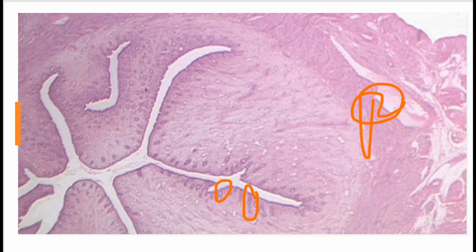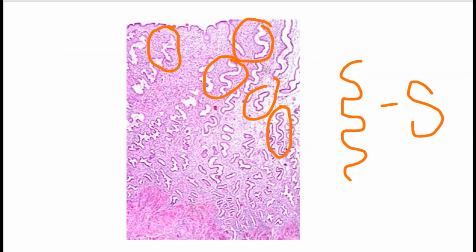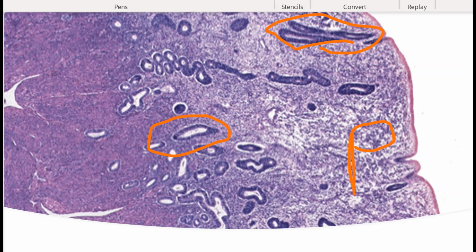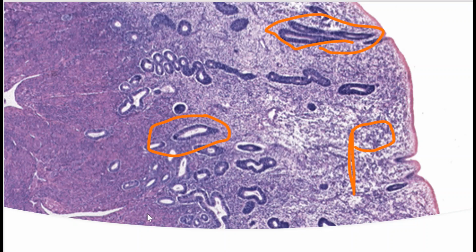Okay. So now that we've figured that out, let's go back and do our layers. So I'll show you on this one. Or no, not this one. This is not the one I wanted to use. Sorry. This one. So let me just erase here.